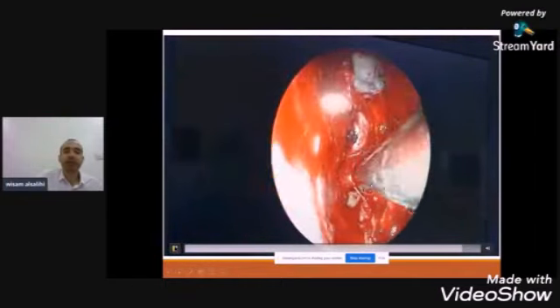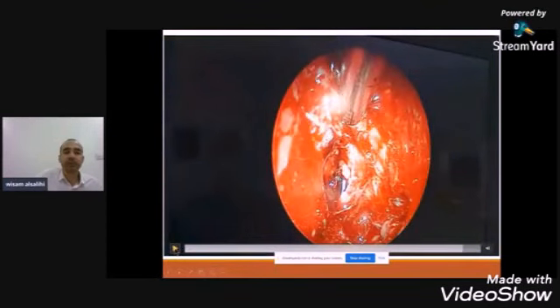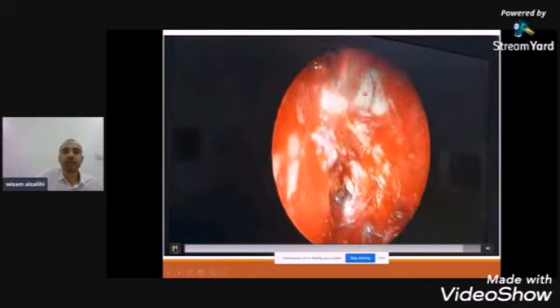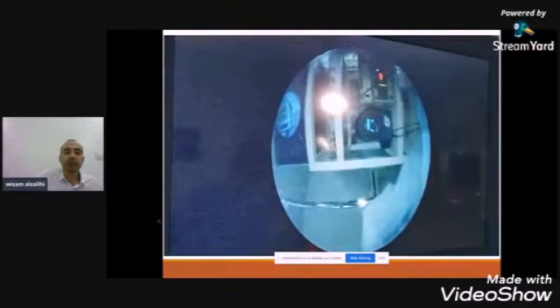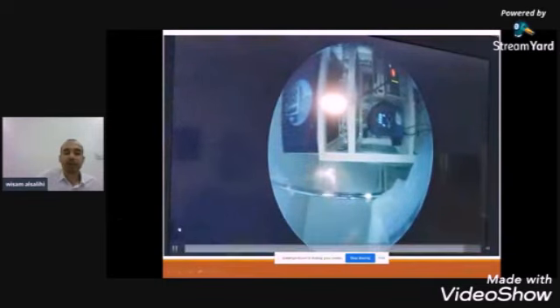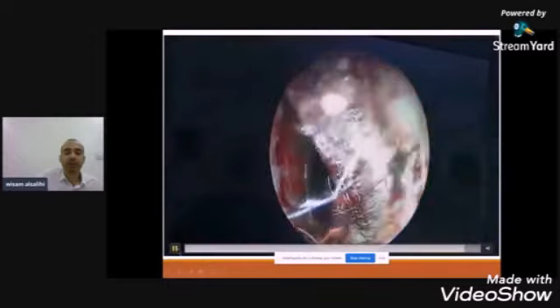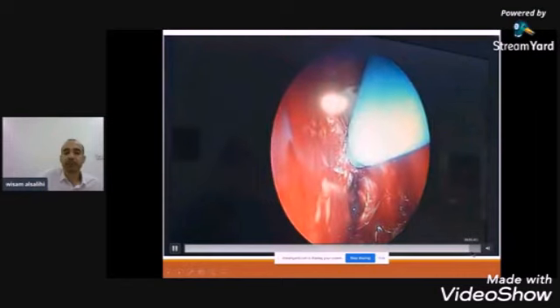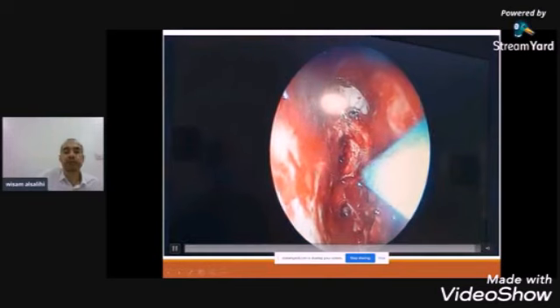See how fast and how easily the artery can be damaged during surgery. This is the artery. This is the anterior ethmoidal artery. And this is the shaver. I have to examine the orbit. It can be dealt with easily by cautery. And now bleeding has stopped.